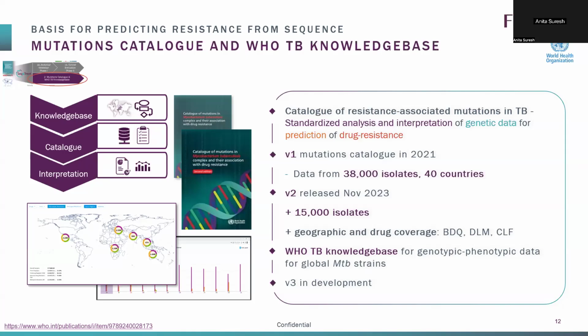So this is just to say that as countries are building their own databases, this catalog is something that helps in the design of new diagnostics. And that is going to be critical, be it molecular PCR-based tests or sequencing-based tests, to ensure these tests keep up with emerging resistance and the new drug regimens, because these treatment regimens are being rolled out actively. And as they get more widely disseminated and have wide uptake, you're going to see, unfortunately, some of this resistance emerging. So you want to make sure the data is going in here and being captured, so the tests also keep up and we are able to continue to get the right treatments to people.